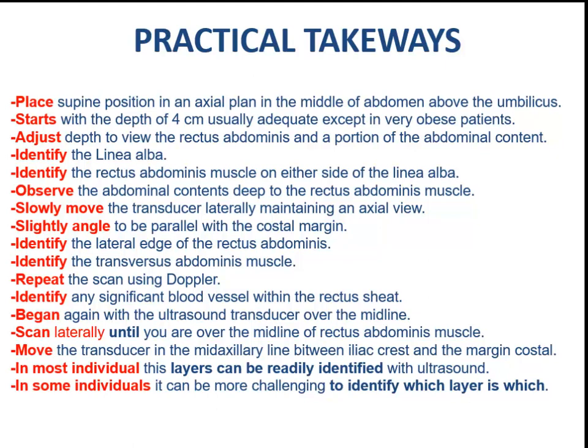Begin again with the ultrasound transducer over the midline. Scan laterally until you are over the midline of the rectus abdominis muscle. Move the transducer to the midaxillary line between the iliac crest and the costal margin. In most individuals, these layers can be readily identified with ultrasound.